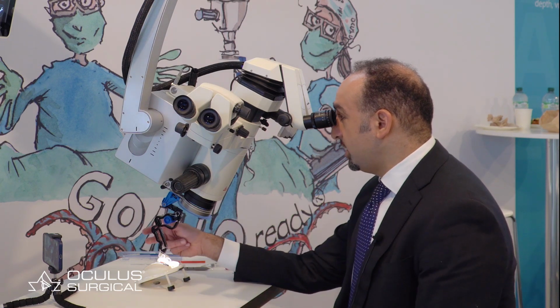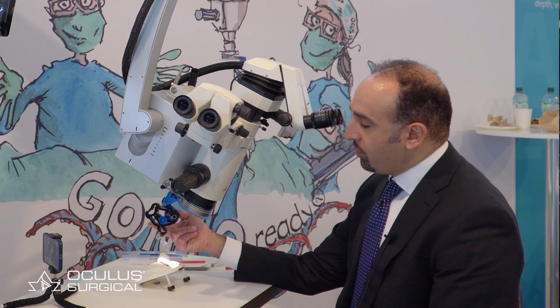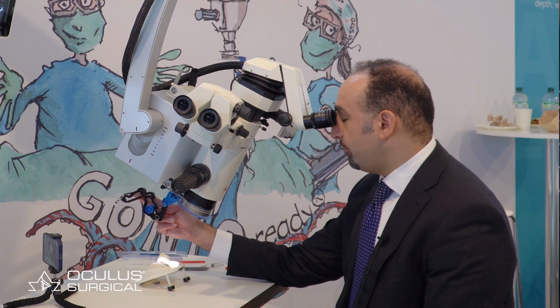And then when one is done with the MIGS portion of the procedure, you simply lift up the Gonio Ready and turn it out of view, and that's all.